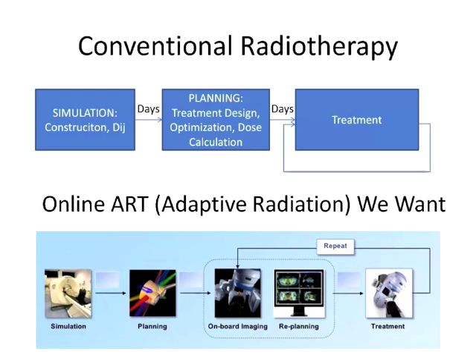That configuration, the source, has to be optimized, and finally the radiation dose on the patient's body has to be calculated to make sure it matches the treatment design that the doctor originally wanted. And the process and tools are very slow currently, using poor machines. And then after a few days, we call the patient back.